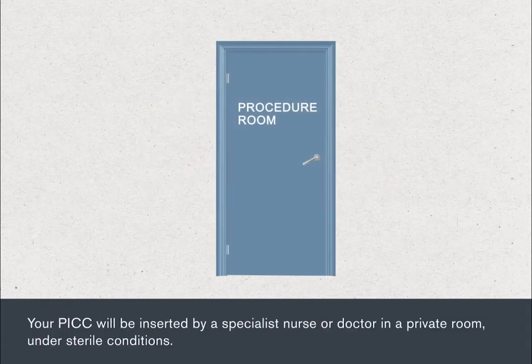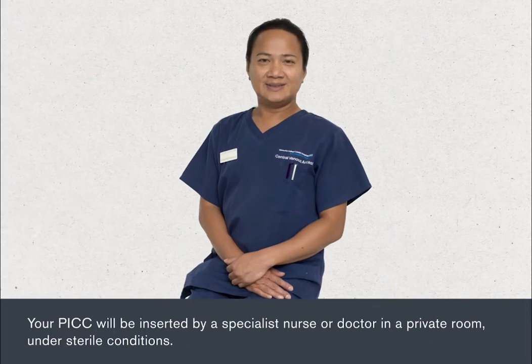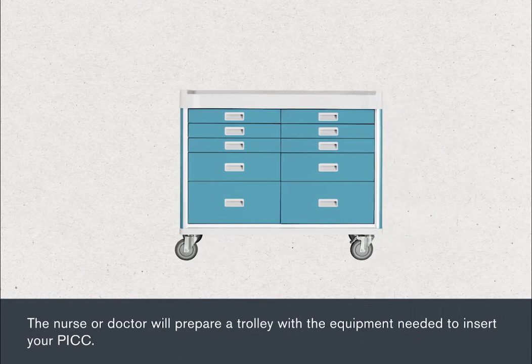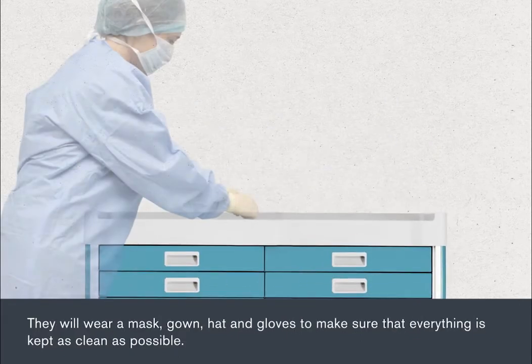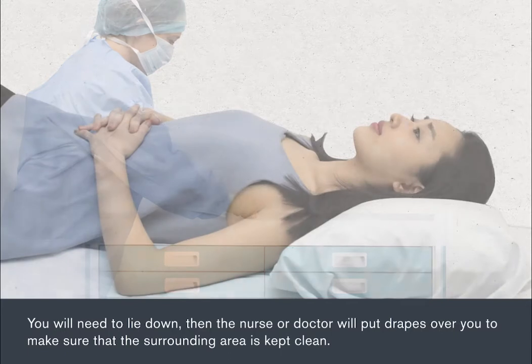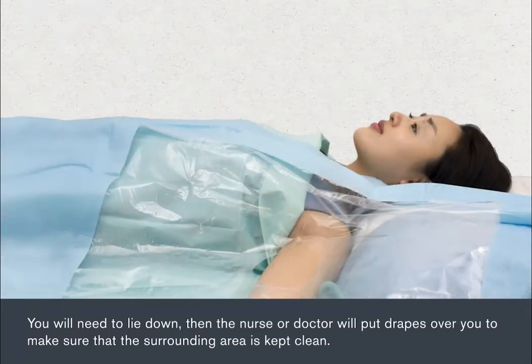Your PICC will be inserted by a specialist nurse or doctor in a private room under sterile conditions. The nurse or doctor will prepare a trolley with the equipment needed to insert your PICC. They will wear a mask, gown, hat and gloves to make sure that everything is kept as clean as possible. You will need to lie down, and then the nurse or doctor will put drapes over you to make sure that the surrounding area is kept clean.